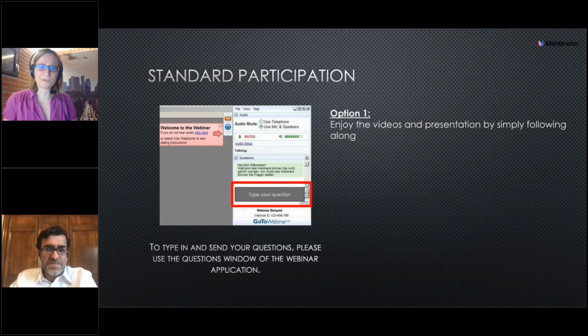Yeah, so basically if you adjust the millisecond value for the envelope on the laser, within that pulse envelope there is an on and off. You have chopped pulses in microseconds.